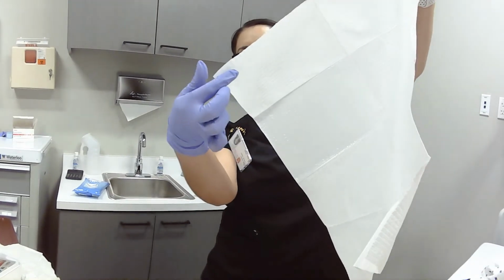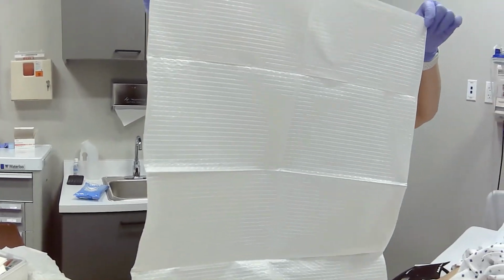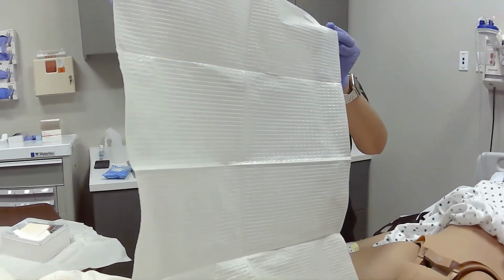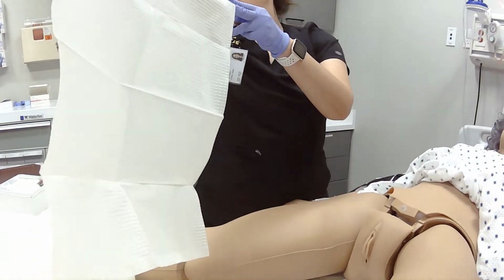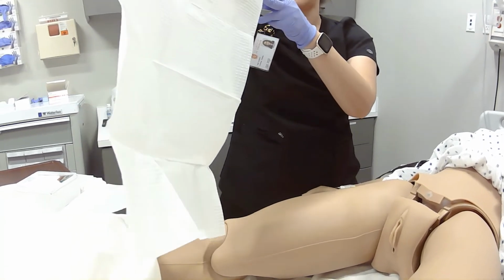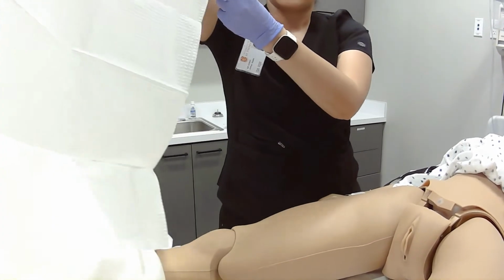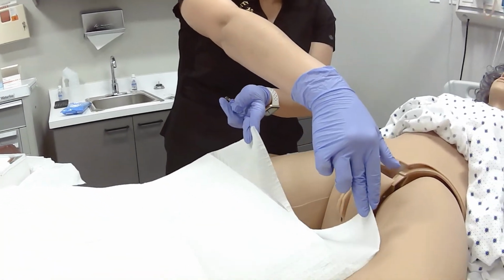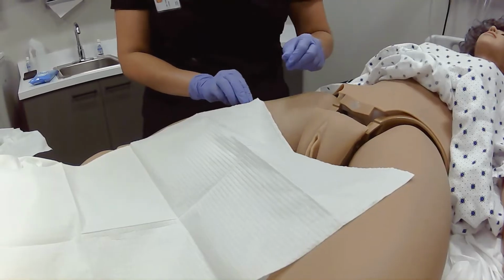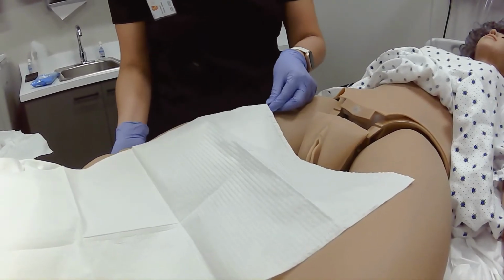Just be very careful not to contaminate. And once I have it stretched out, I also want to make sure that I don't turn my whole back to my sterile field, because if something contaminates it, I would not be able to tell. So then I'm going to lay this down and carefully place it between my patient's legs.